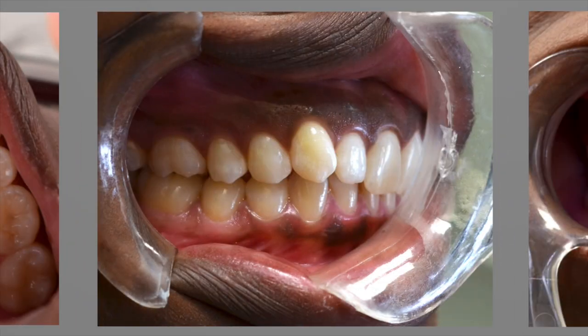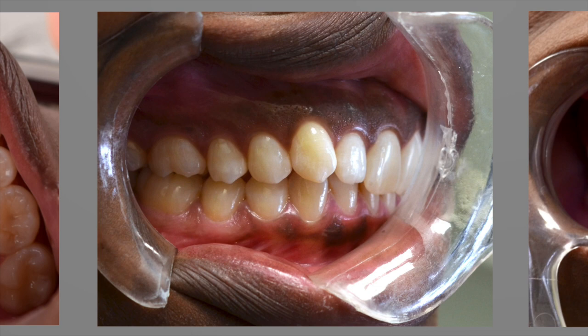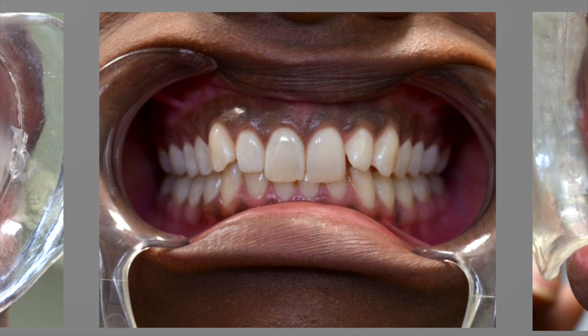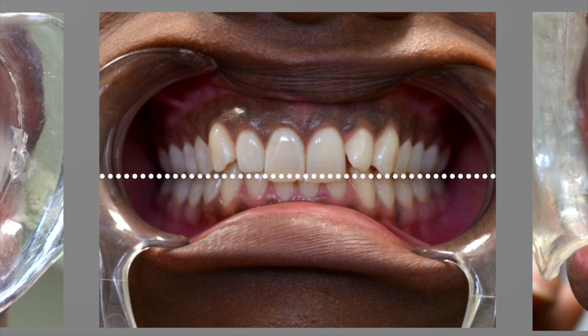The left and right lateral photos should include all the teeth and attached gingiva between the first molars and both central incisors. The occlusal plane should be parallel to the frame, and teeth on the far side of the arch should not be visible. The frontal intraoral photo should feature an equal display of posterior dentition, with the teeth in occlusion. The occlusal plane should be horizontal, bisecting the photograph.